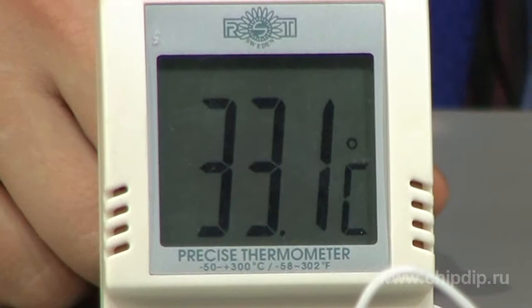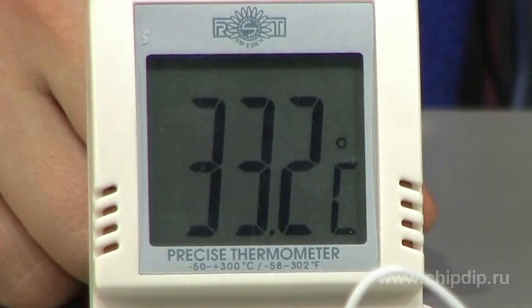All information is displayed on the LCD screen and is updated regularly based on data received from the sensor. The measuring frequency is one time per second.